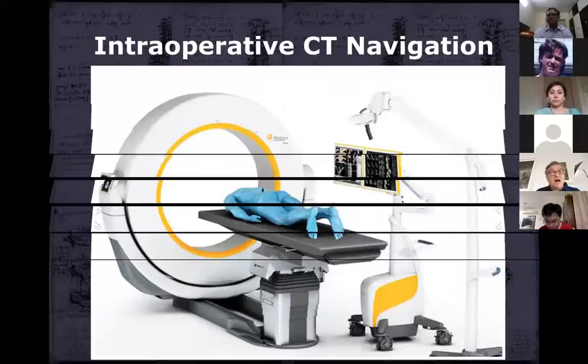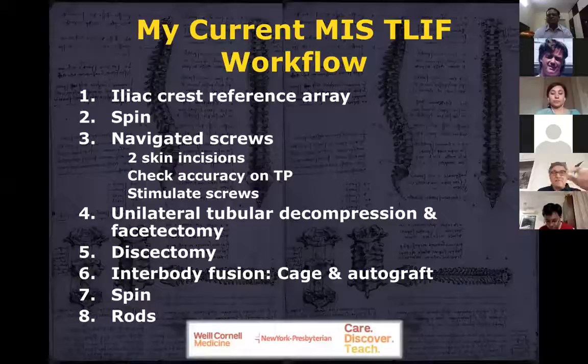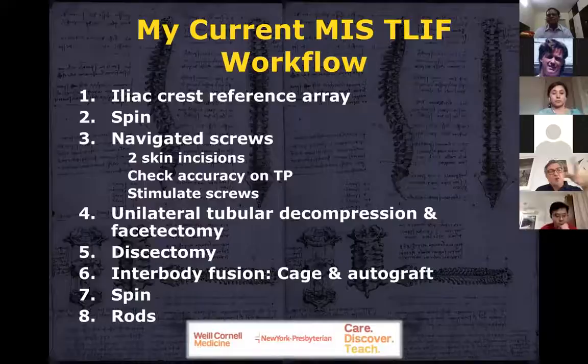The workflow for MIS TLIF that I currently use is depicted on the slide. I insert the reference array for the navigation into the iliac crest. We get a spin, and then we navigate the screws. We insert the screws through two skin incisions.